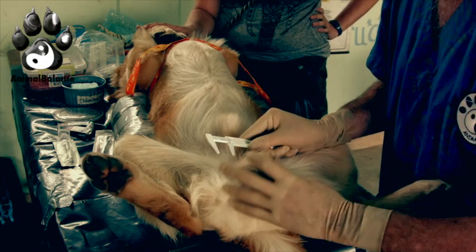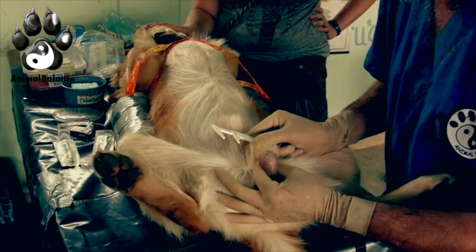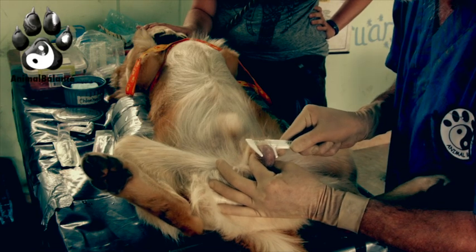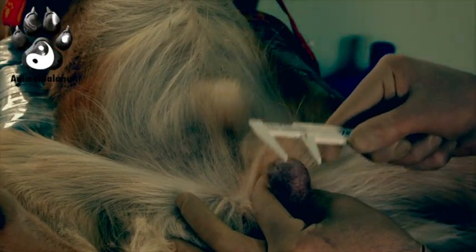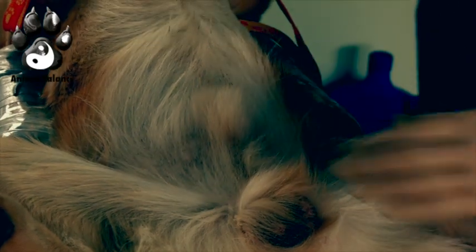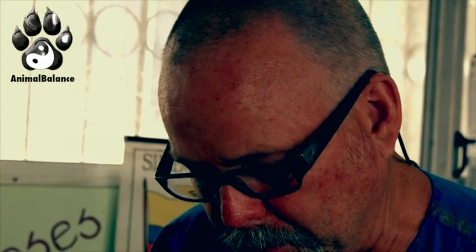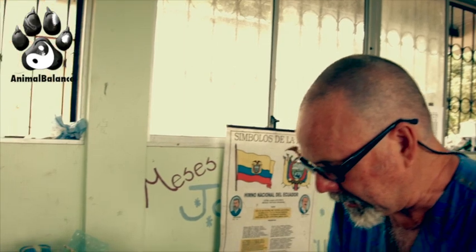We gently manipulate to pop the other testicle out of the way and measure the left, which is also 0.8cc. The nice thing about this procedure is we can perform non-surgical sterilization without a lot of preparation — we don't need to clip the dog and we don't need sterile instruments.